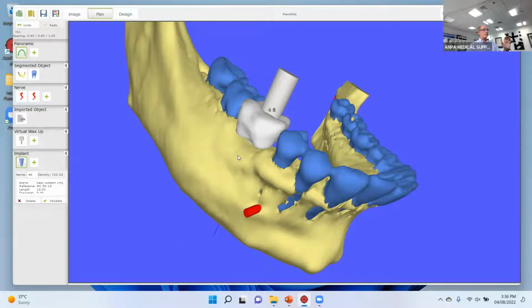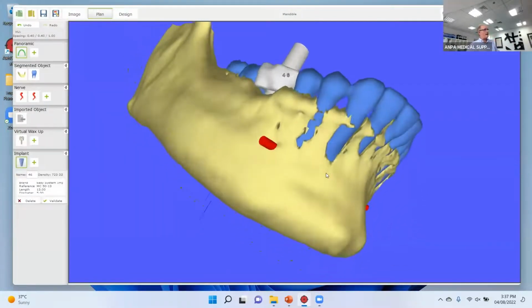And some of the bad issues happened when I had a screw retained abutment and a cement retained crown on top of the abutment. In some cases, the screw is unscrewing, and then the tooth is moving, but you cannot separate the tooth because it's cemented too strongly. Okay, so for this reason, I rather like to have my teeth screw retained directly on top of the implant, easy to retrieve and very quiet. Okay, so you know how to plan this implant.